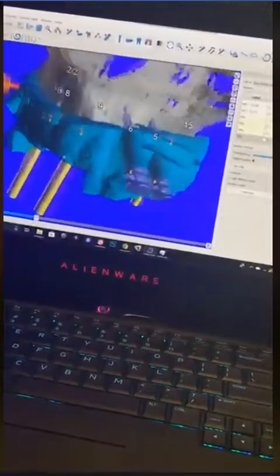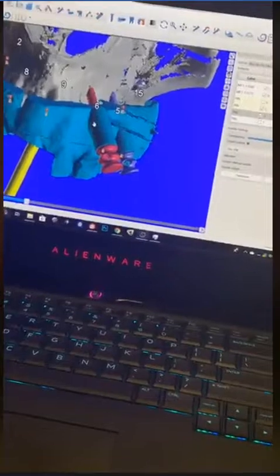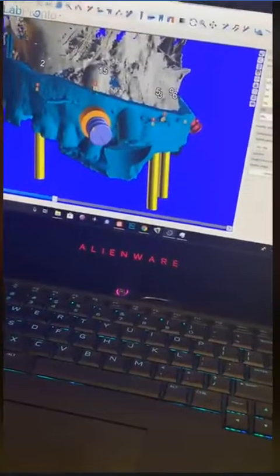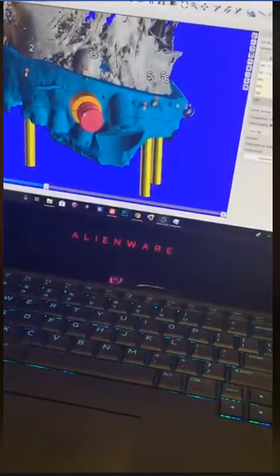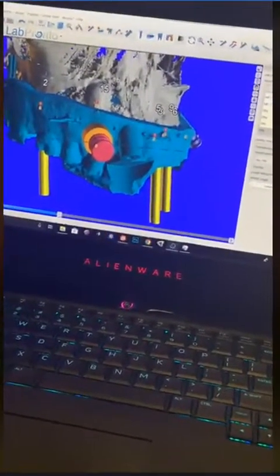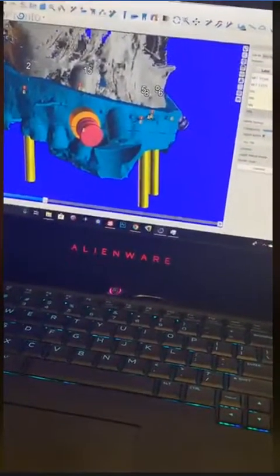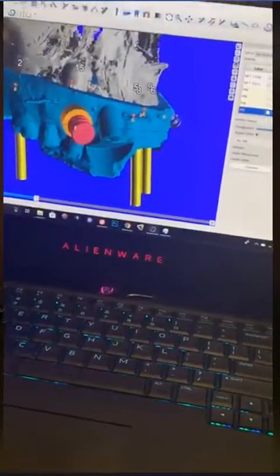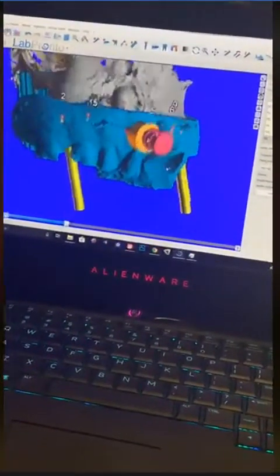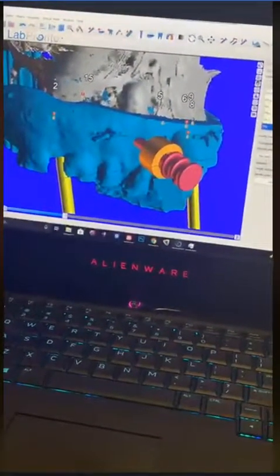You see how my guide tubes are so much longer? This, number one, gives you a better guide, okay? And number two, if I get rid of the implant in this area, just to show you, one second. So it actually does not allow me to go ahead and, maybe that's because it's, okay.